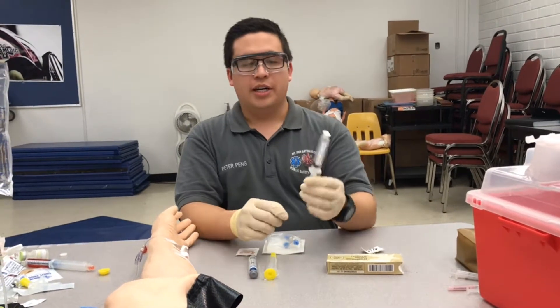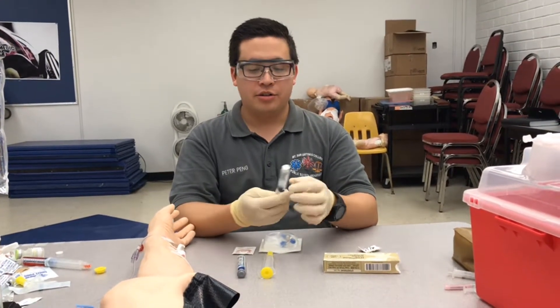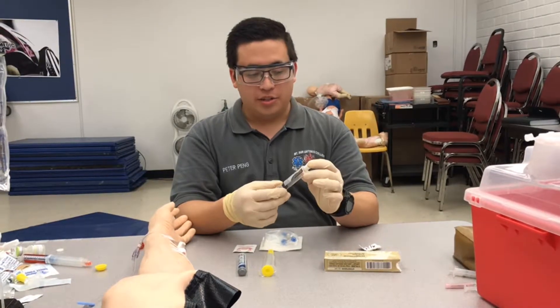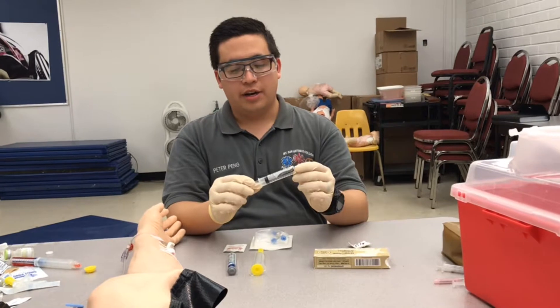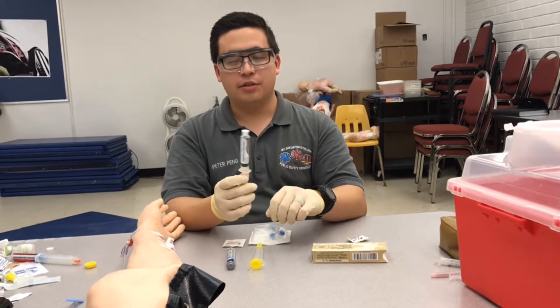I'm also going to DICE my flush. I have a 10 cc pre-made flush and it is normal saline, 0.9%, good clarity, good integrity, and expires 10 of 2018.